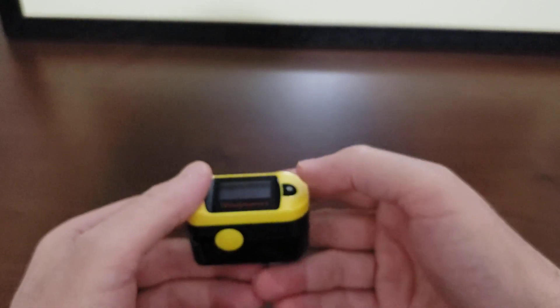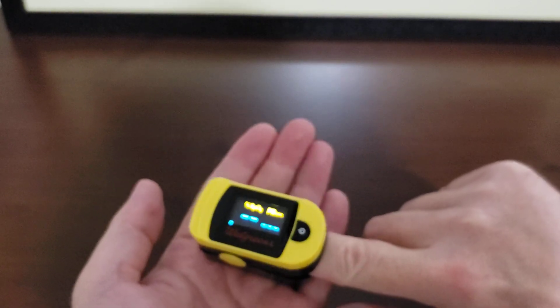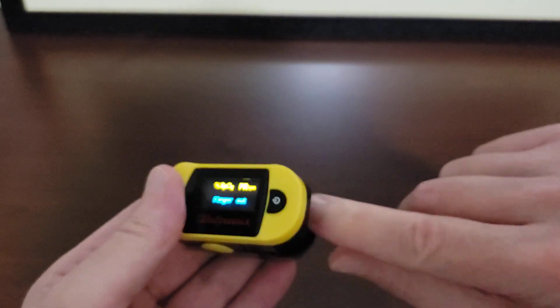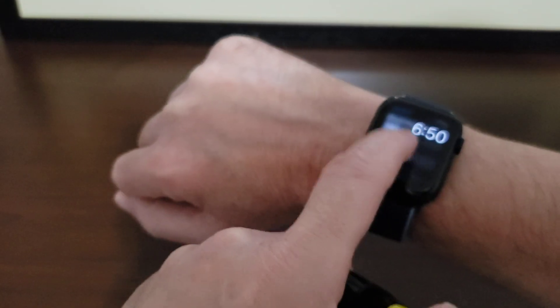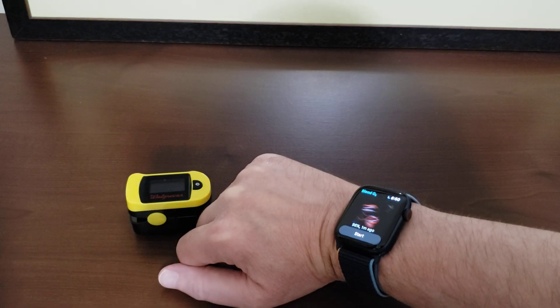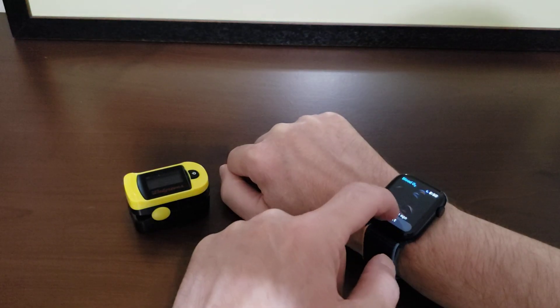Now we'll try the fingertip pulse oximeter variant. Let's turn that on and get the finger in there. 97% on the fingertip pulse ox. So we have 97 on the fingertip and 98 on the Apple Watch. We're going to do that again to see what kind of results we get. Let's click done, get the wrist flat, and tap start.